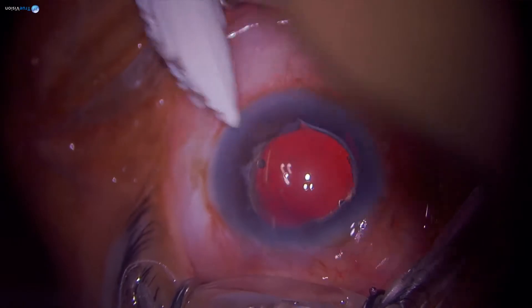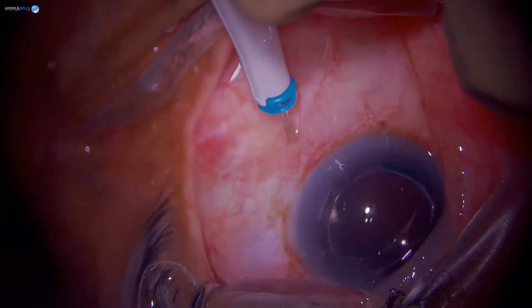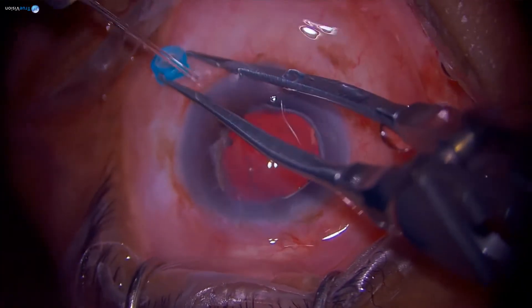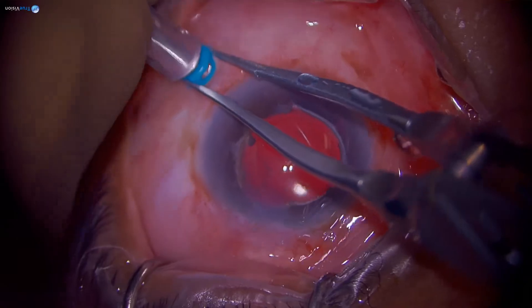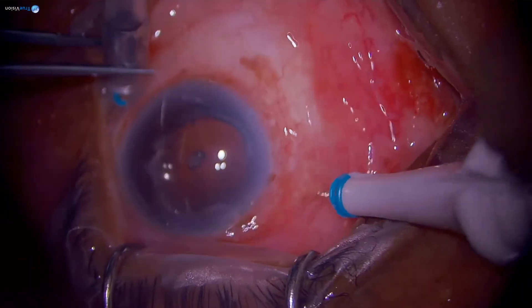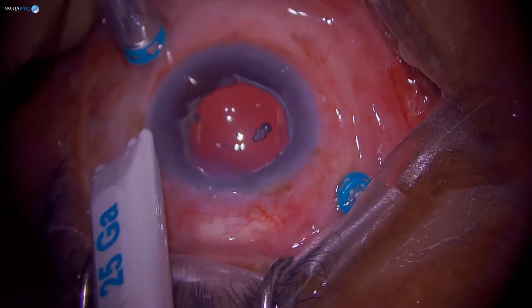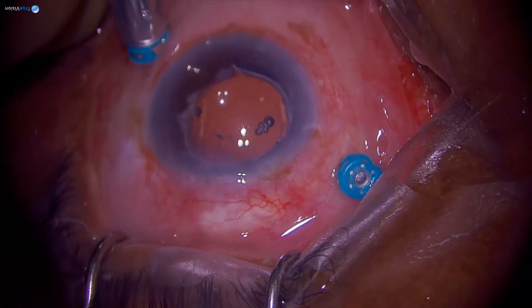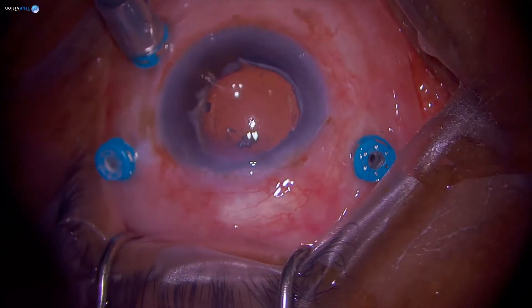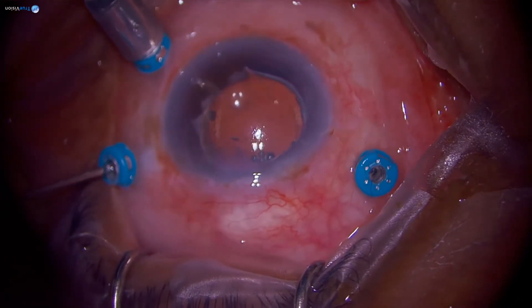We will start the case by placing three cannulas. Port placement from the limbus is based on the lens status of the patient. The previous case was a phakic eye and we measured four millimeters. This one is pseudophakic, so we do about 3.5mm. The upper two ports are just above the horizontal meridian; the inferior one is about two to three clock hours below the horizontal meridian.